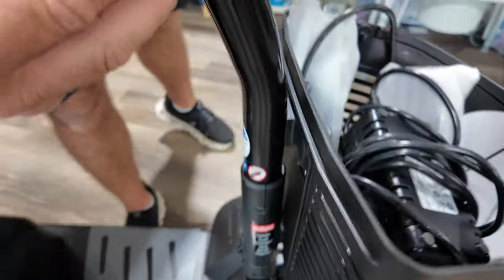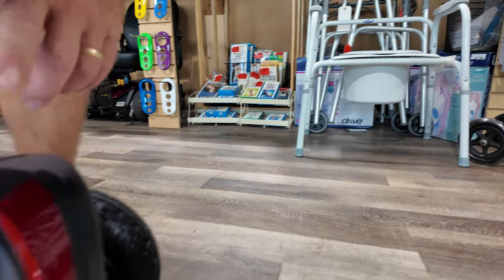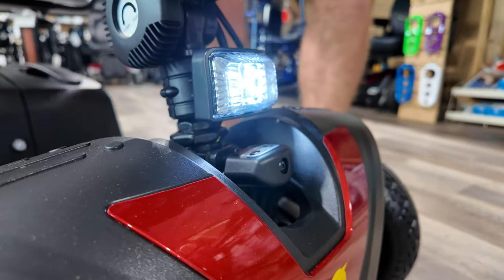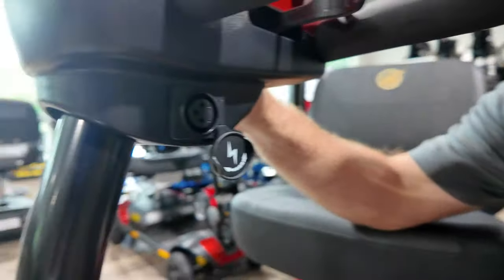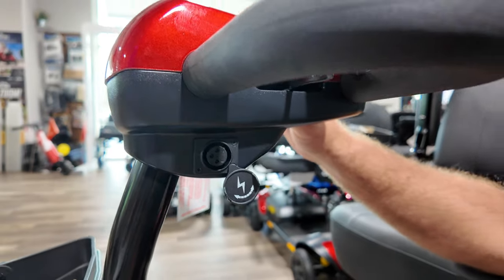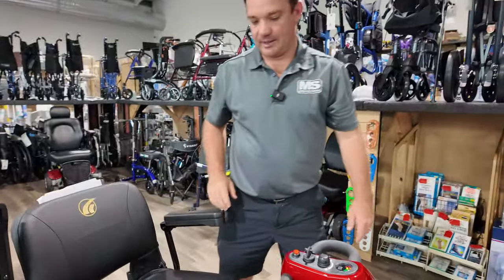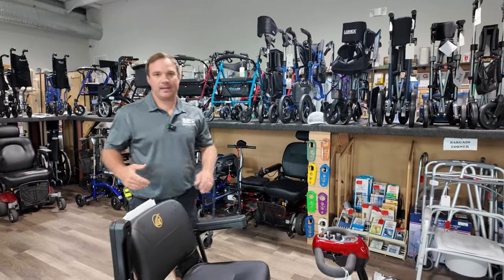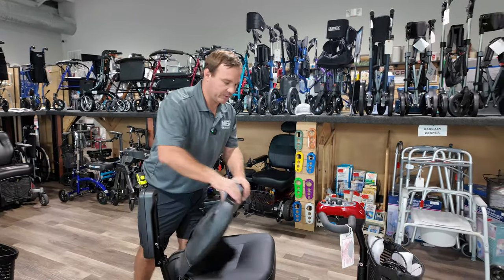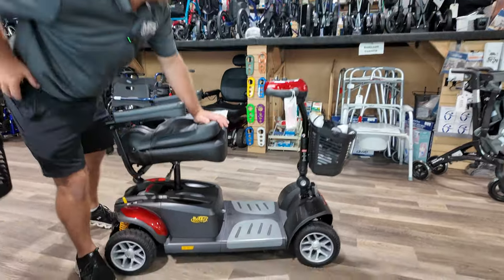Right here you're going to find a rocker switch to turn your front light on, which is convenient. On this side is where you can charge the unit — you can charge it right through here with the charger that comes with it. The shrouds can be changed to different colors. It's going to have U1 batteries for about 18 miles depending on the terrain. The tires are pretty large.